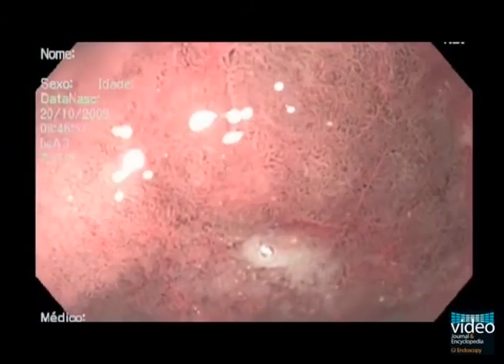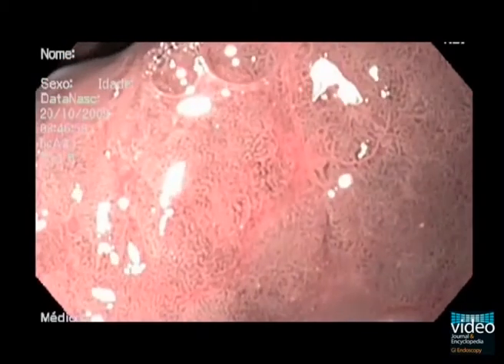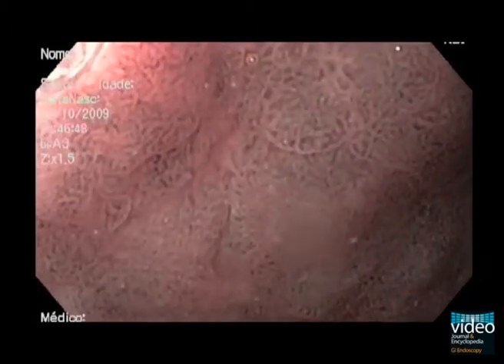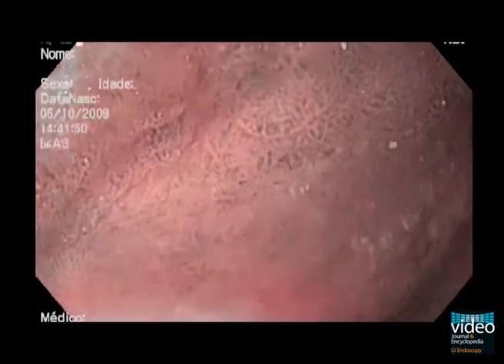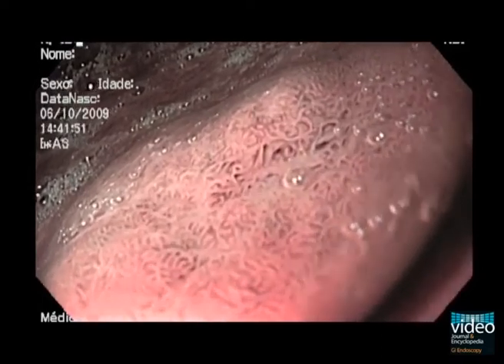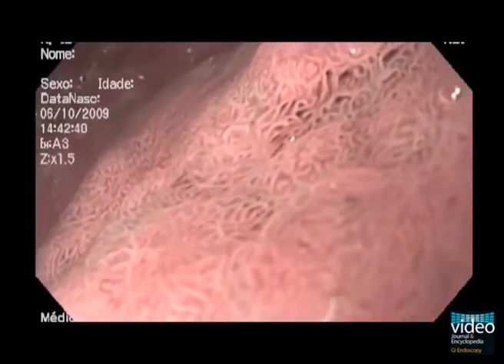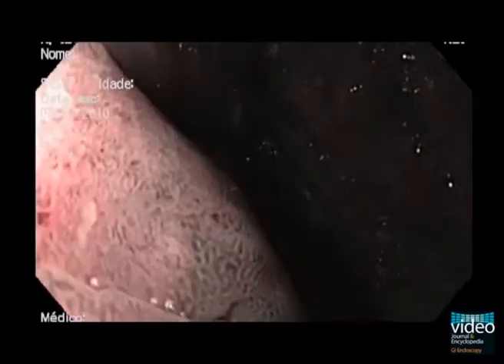A small area of low-grade dysplasia presents with a discrete area of irregular glands and vessels. In two flat lesions with high-grade dysplasia, there is a complete architectural loss of both the mucosal and vascular pattern.